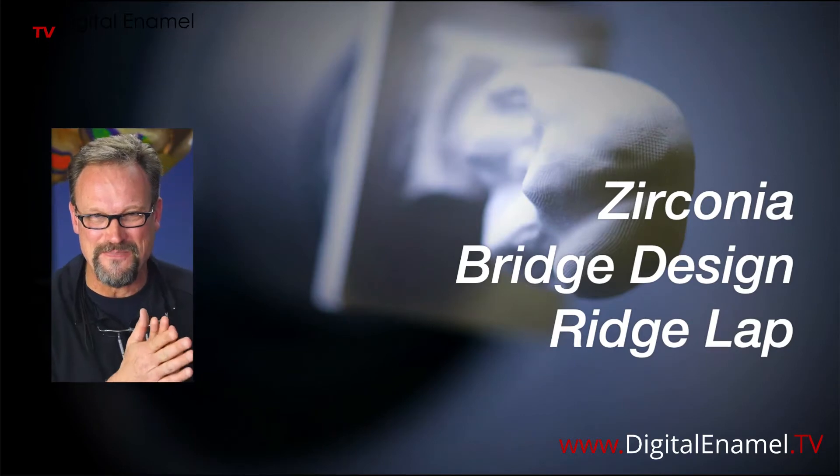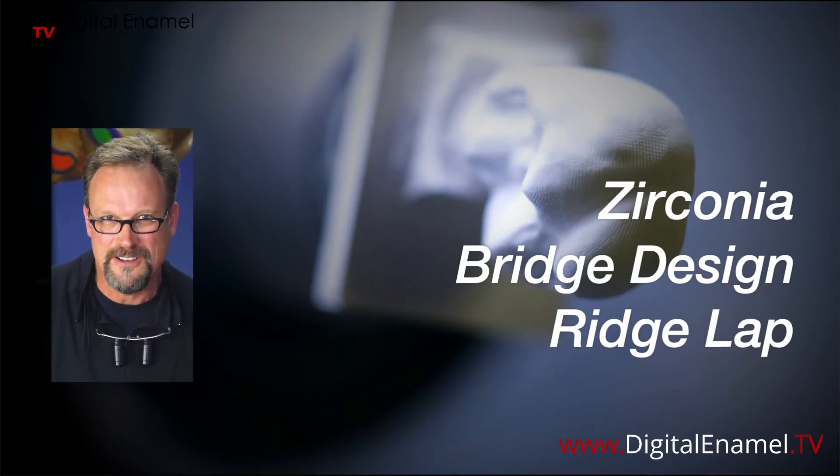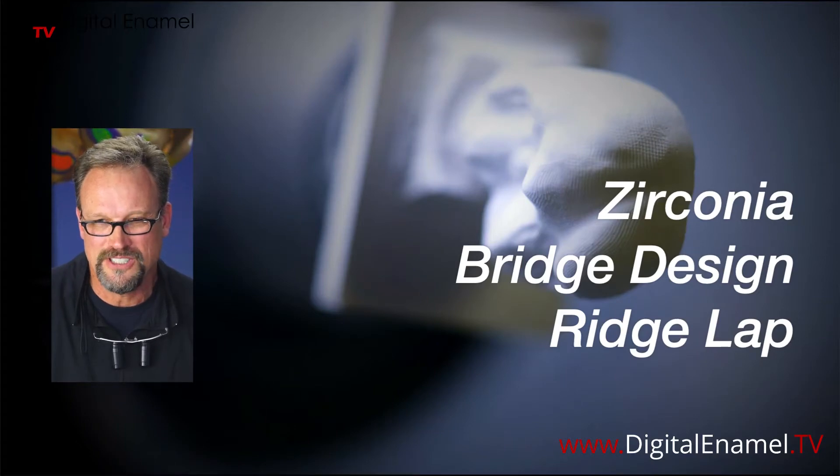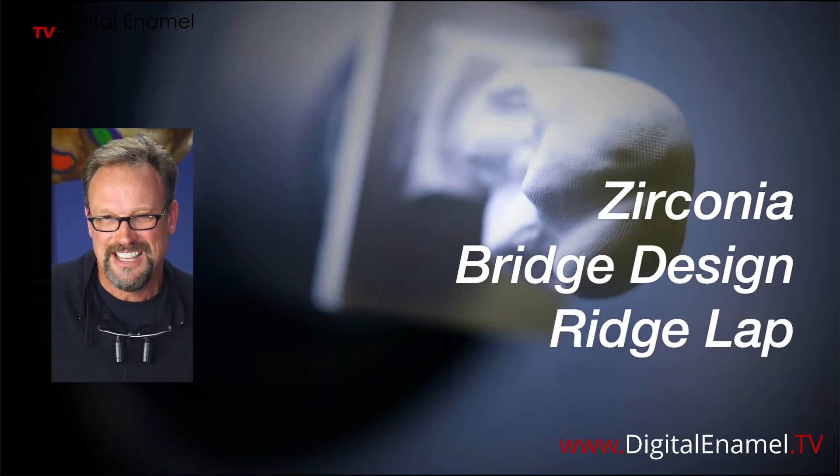I was making some videos tonight and I did a really long one on zirconia bridge design. I thought I'd just go live real fast and show one little quick nuance — something that makes bridges a little bit better.